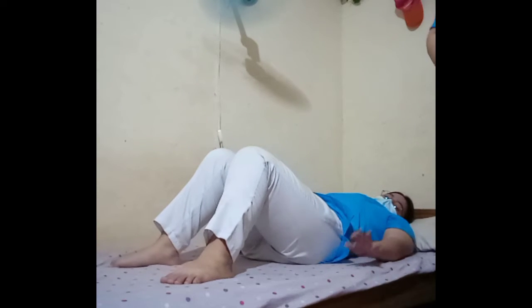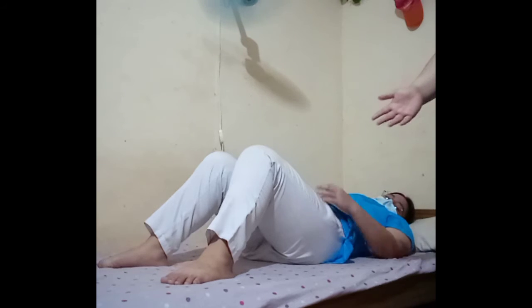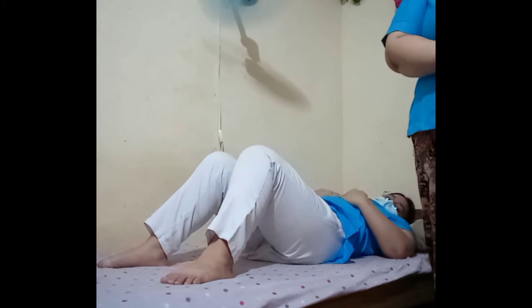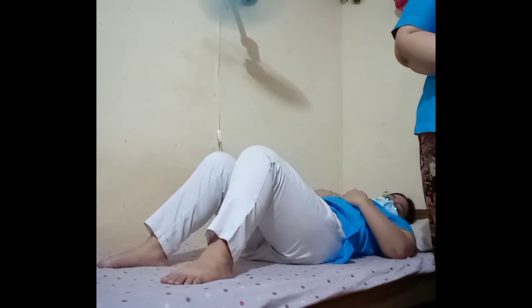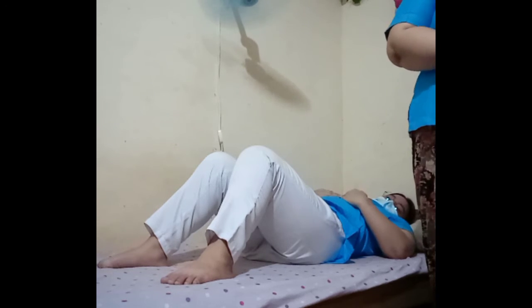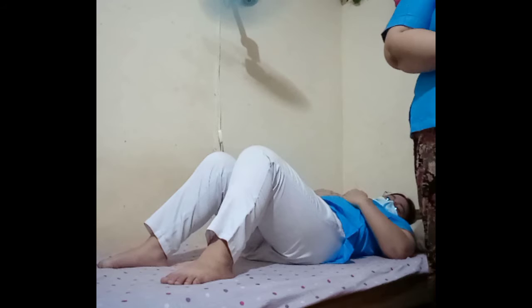Okay. So, for the patient position, make sure that the patient will have a pillow for its comfort, and the patient will be in a supine recumbent position. So, for the part position, first let me explain. For the part position, align the femur to central ray and midline to the IR. So, we have to ask the patient to adjust and position at the midline of the table to have more correct position. So, please do not forget to internally rotate the leg of the patient 5 degrees.